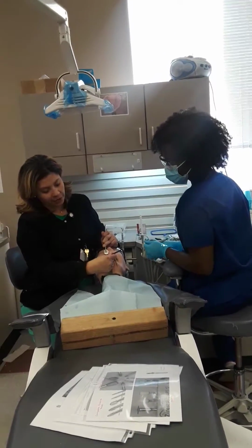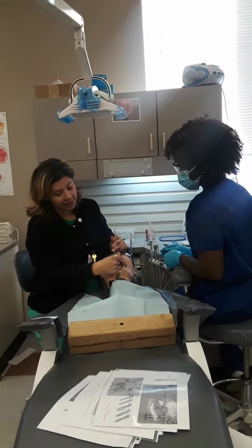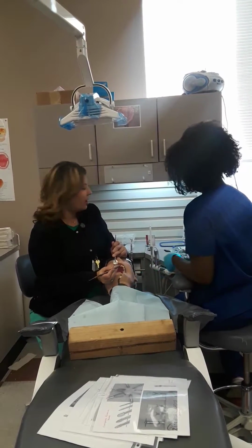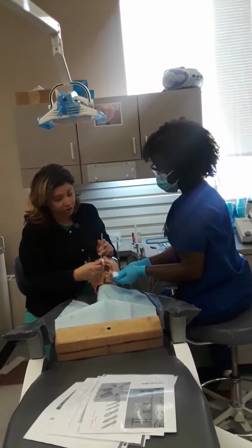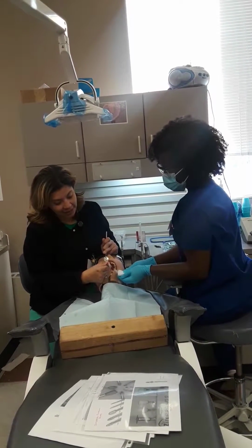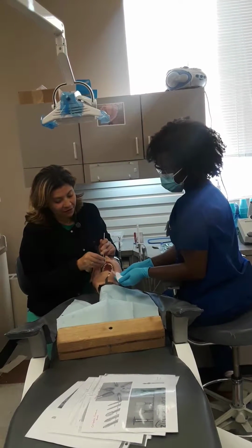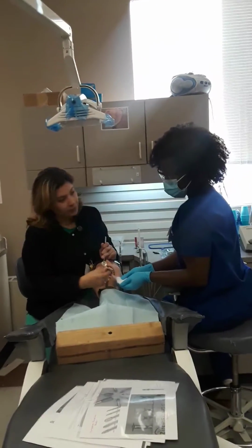And then we're going to mold. I don't know what your step says, but don't forget you pass your composite instrument to mold it to the tooth. And then get some gauze to wipe off my excess material as I'm molding, because if we cure the excess, that means I have to trim it off later. So that's why I'm taking as much excess material off the tooth now, prior to cure, because I don't want to remove it later. I want my filling to be almost done before I cure it. Okay.